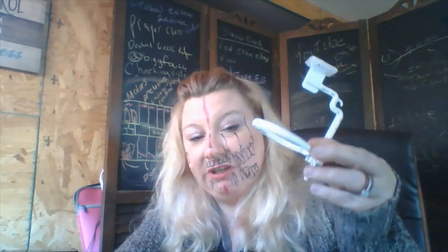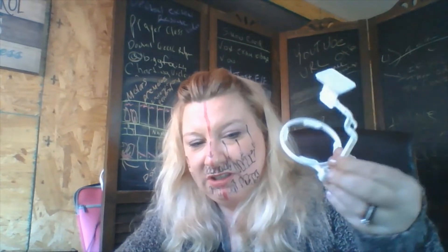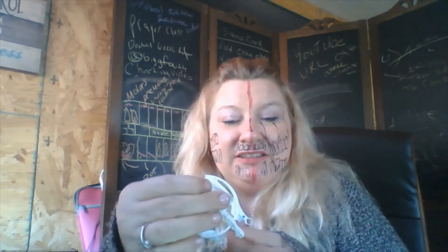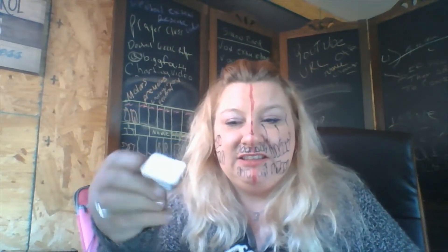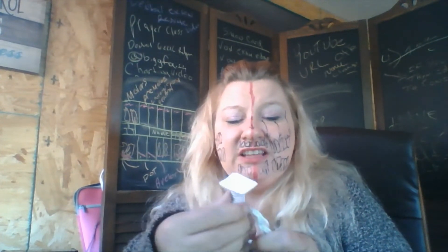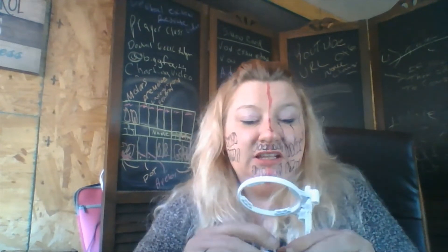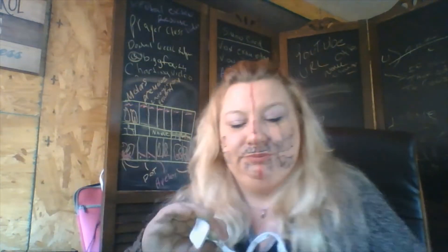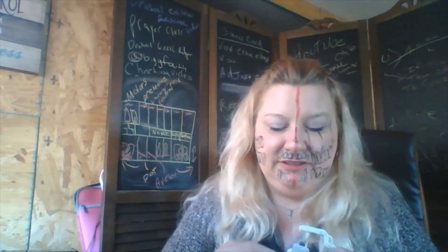We're going to talk about placement of the ring kit. This is a one-ring kit for all the teeth, used a lot for digital nowadays. It has a little sticky paper — you just take this part off; it's disposable after every patient. Some of these have four straps that you velcro or tape onto the sensor. This one just sticks to it as well. You slide it in, and it has the same colors: yellow for posterior, red for bite wings, and blue for anterior teeth.